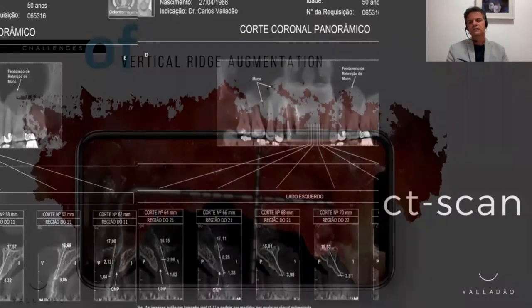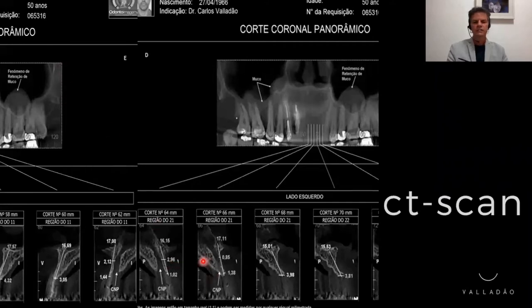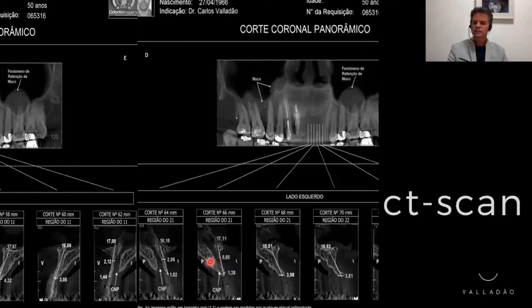Let's start with the CT scan of the anterior maxillary region of this patient. Although the existing bone height appears to be sufficient, in fact, the patient had bone deficiency not only in the vertical aspect, but also in the horizontal aspect.